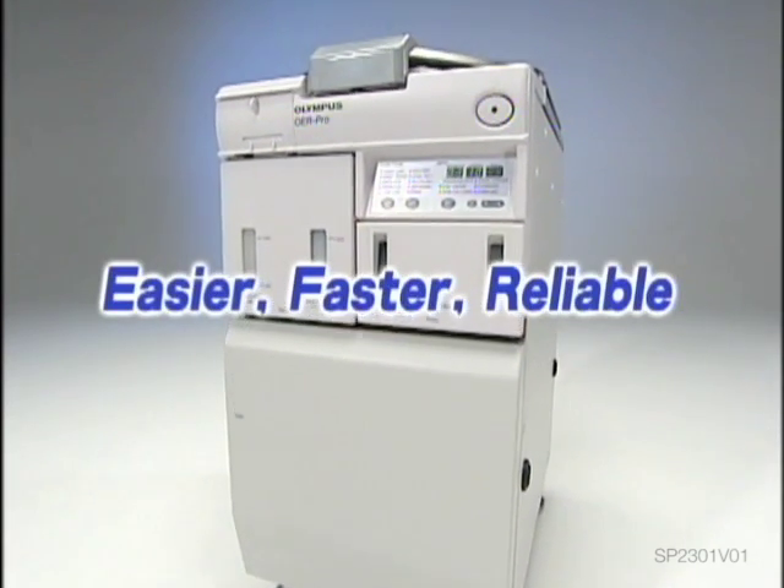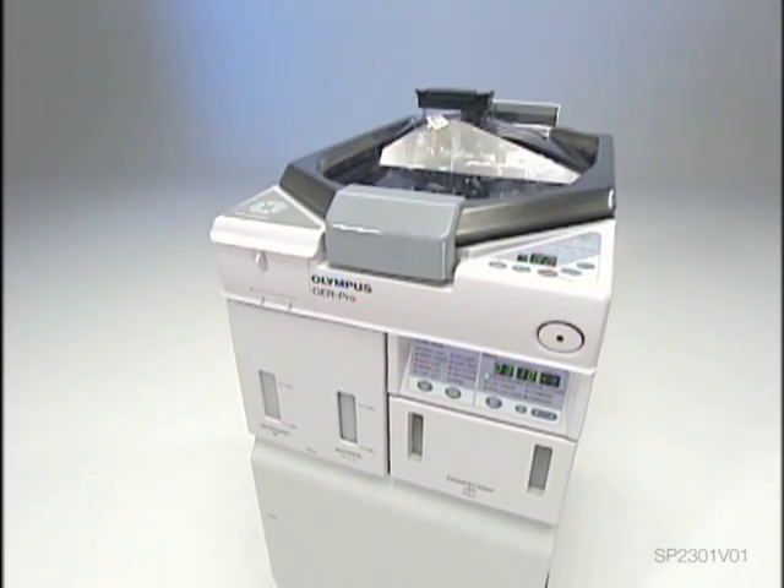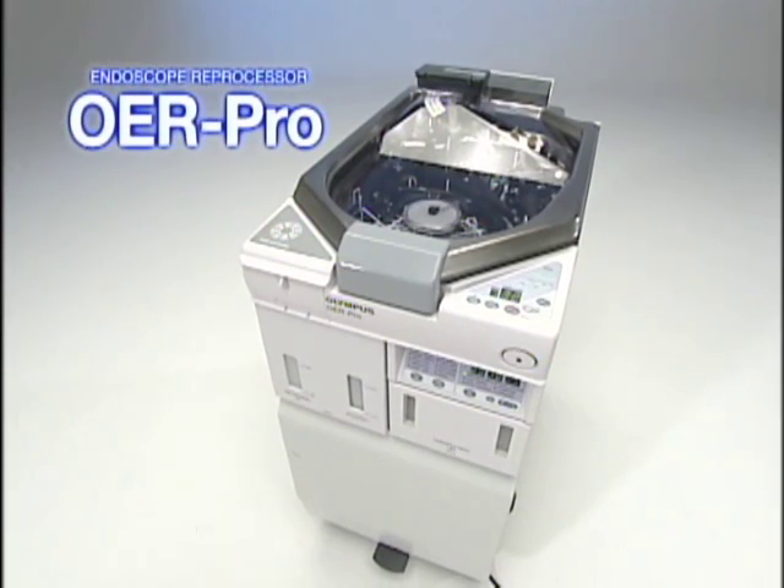Easier, faster, and reliable. It is precisely because Olympus is an endoscope manufacturer that the OER Pro is able to offer such high performance and high reliability.